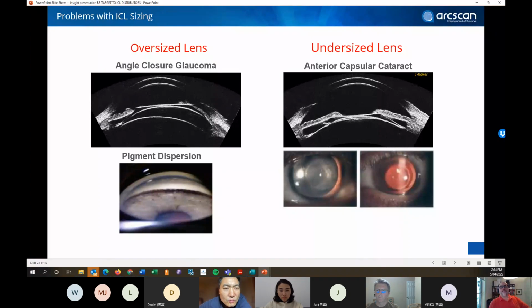You will never be able to achieve an image with any handheld ultrasound like the ones you can get through here. It's almost impossible. It doesn't matter how good you are, you will not be able to do it, because it's that arc that you're moving. Now, I'm sorry to be a little bit of a typical teacher.